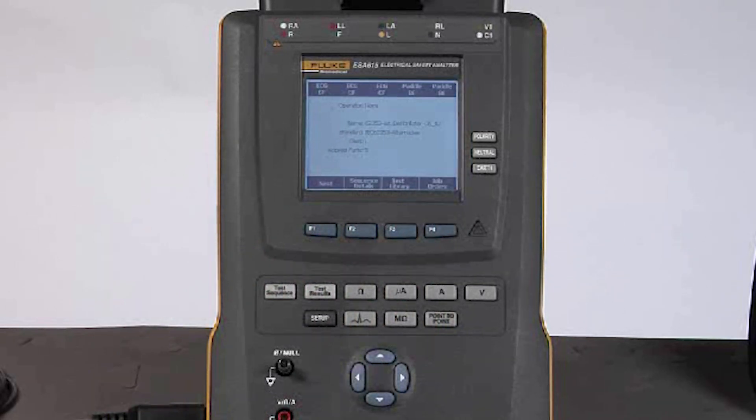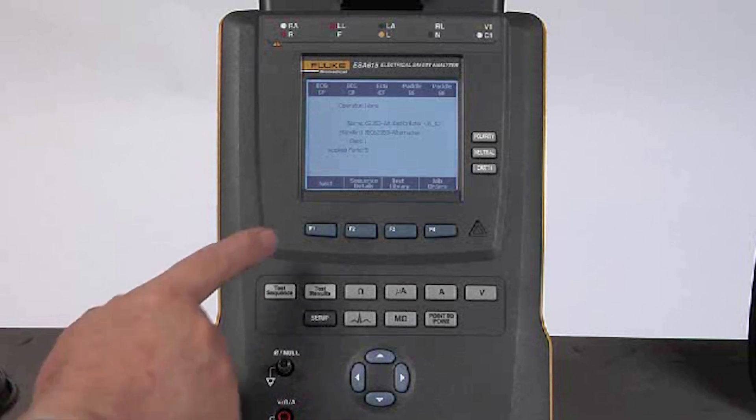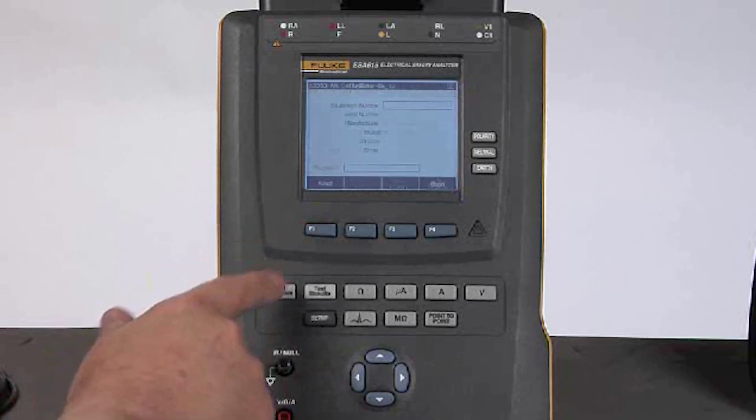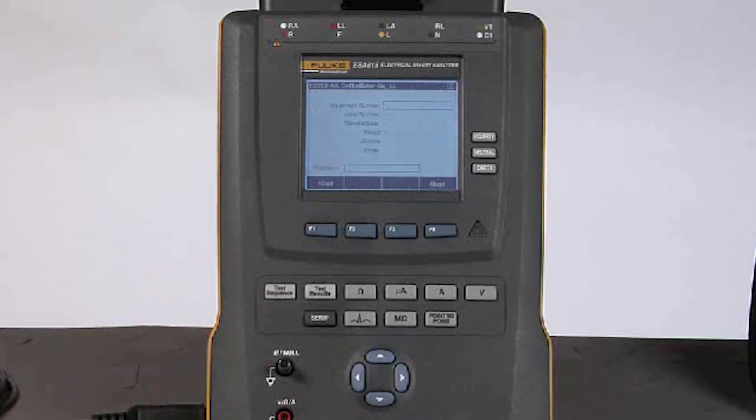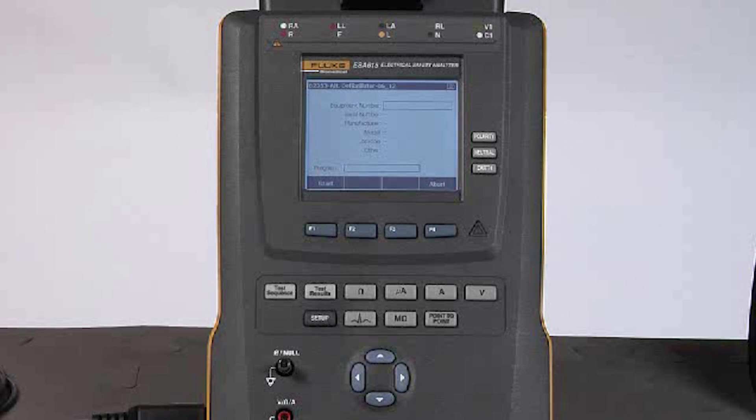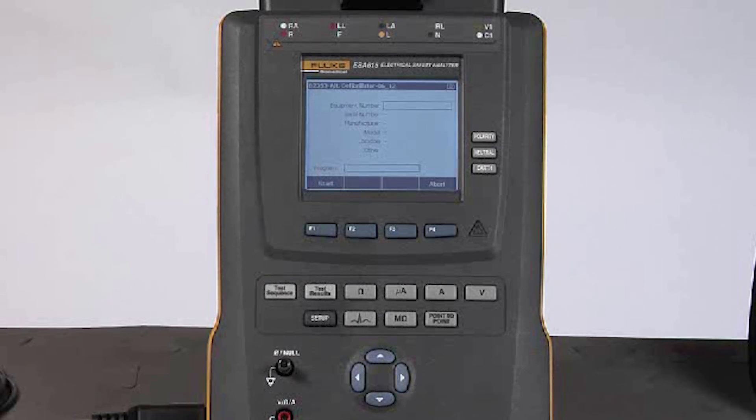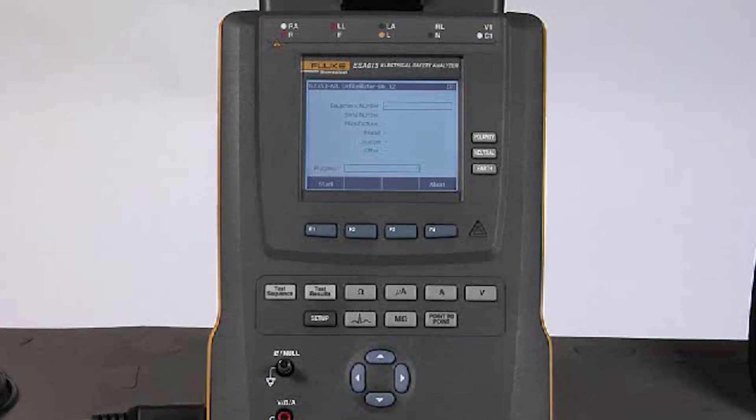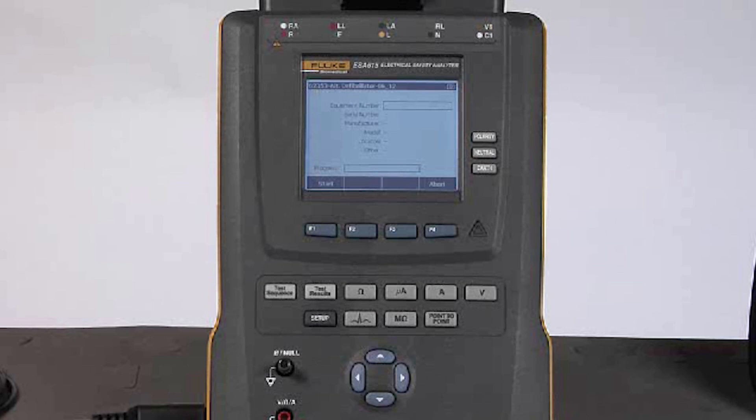If I choose to run the test sequence that I have selected, I will pick the F1 button next. That allows me to enter the device under test information, including the location, whether it be on a particular part of the hospital, in another building on campus, or across town. Once I have done that, I would press the start button to actually run the test sequence.